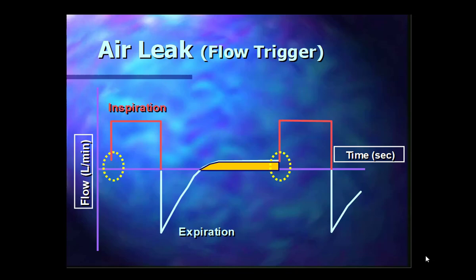During the inspiration or during the expiration? Expiratory mode, right? So, obviously, if there is a leak, it's going to be from the positive end rather than from the negative. So, that's the reason why it is here rather than here. Air leak is manifested by a rise from above the baseline, auto PEEP is manifested as a rise from below the baseline.